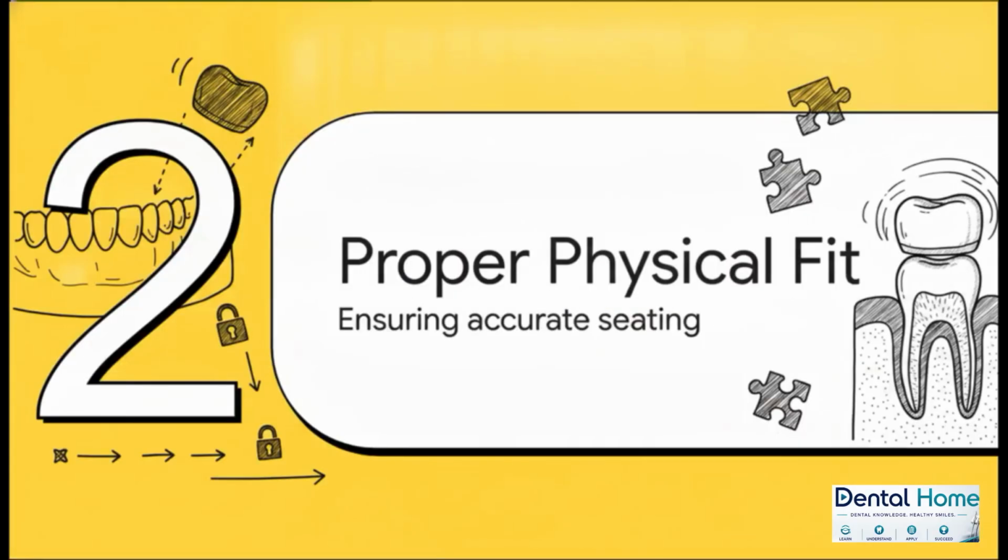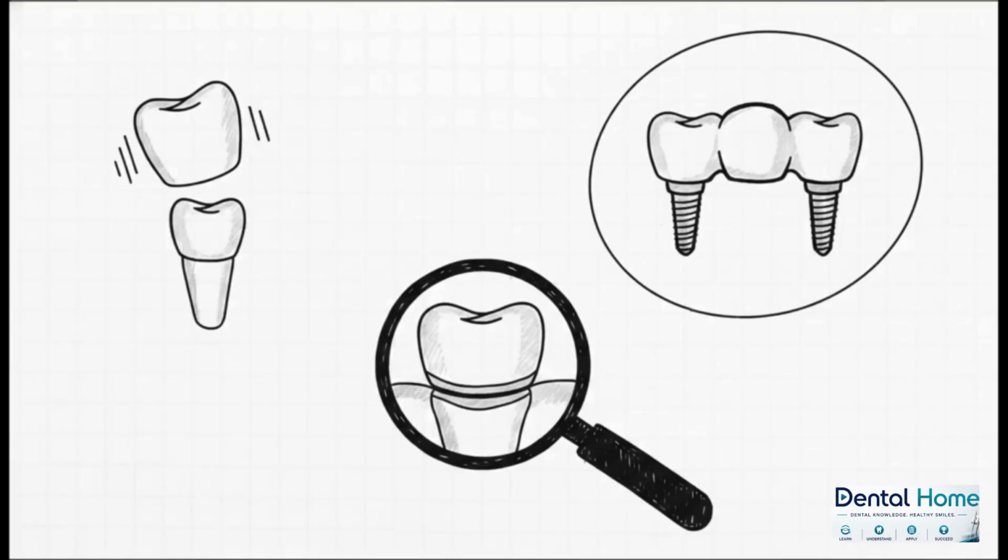Moving right along to Section 2, ensuring proper physical fit. When we actually get this right, a few incredibly important physical things happen. First off, we get proper seating. A common path allows the restoration to slide into place fully without physical interference, giving us incredibly accurate adaptation to the tooth or implant.